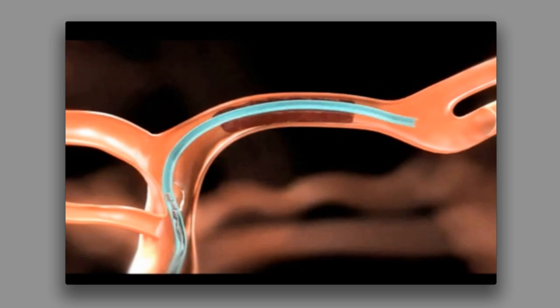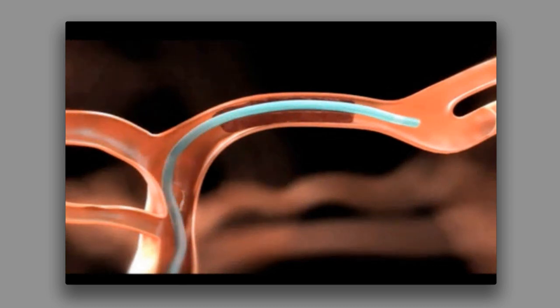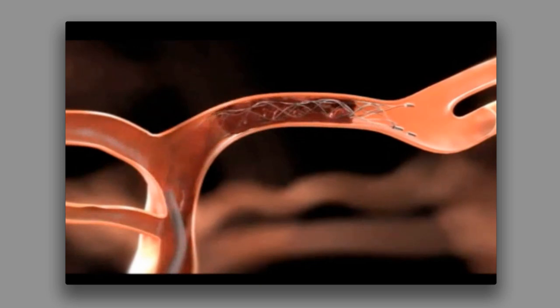The wire is then withdrawn, leaving the catheter in place, and the catheter is used to slowly advance the stroke treatment device into place. With the treatment device across the clot, the catheter is withdrawn, exposing the retrievable stent and allowing it to enmesh the clot.